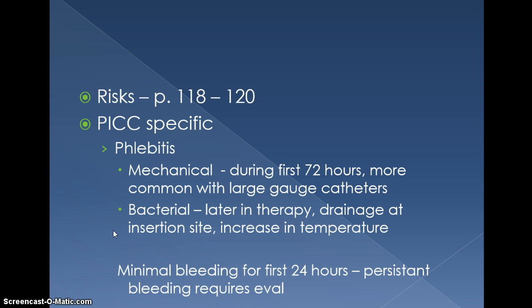Bacterial phlebitis can occur with PICCs. Usually occurs later in the infusion therapy. There's drainage at the insertion site. It's probably going to be purulent, and they may have a spike of temp. So in this case, it may have to be that the PICC line is removed also.